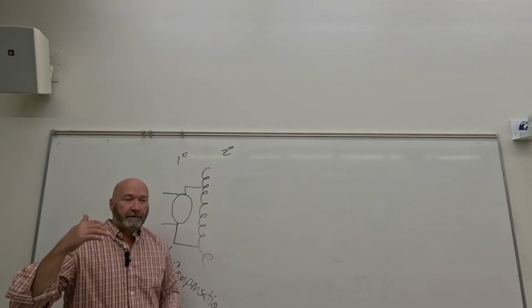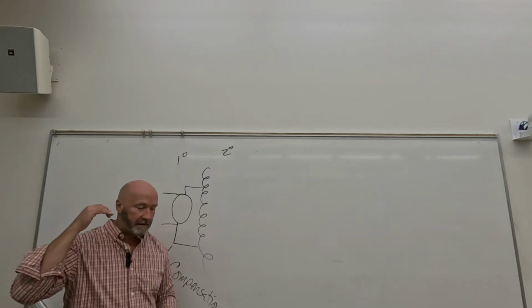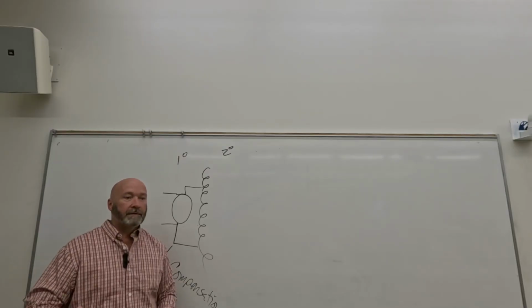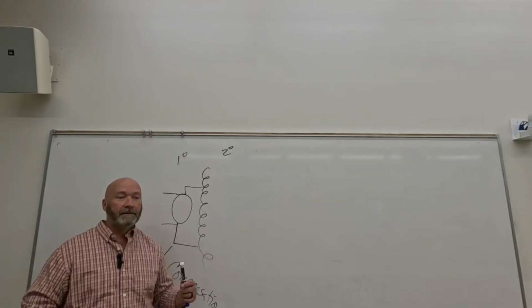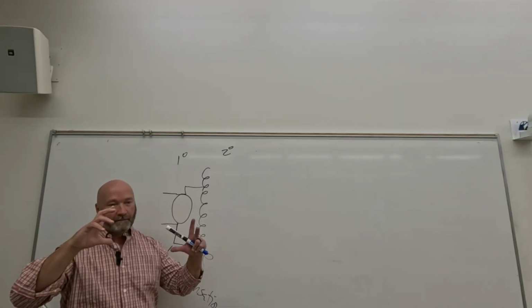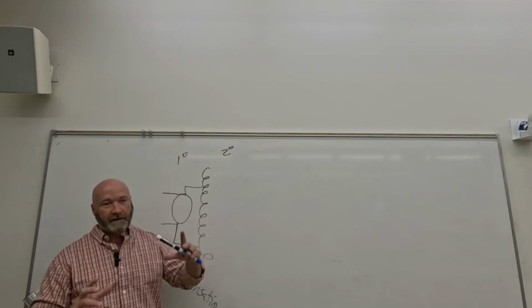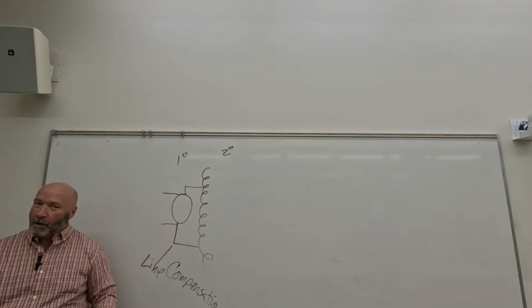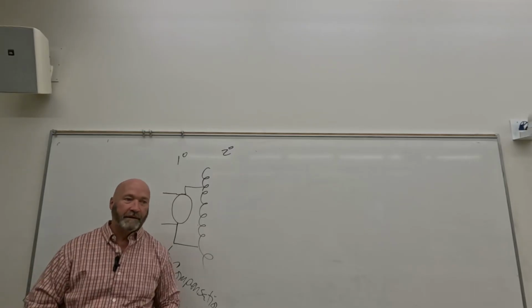There's no need for the high-level characteristic X-rays that we create. So the target material is going to be molybdenum instead of tungsten. The tube is going to be inside of the housing at a funky angle. Totally different. So Mammo's probably going to be 25 to 50 tops.